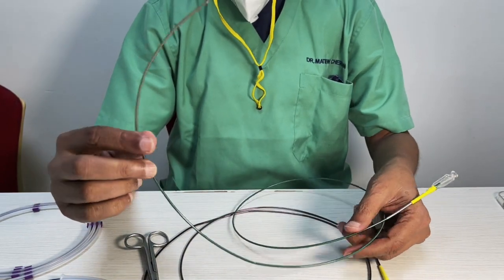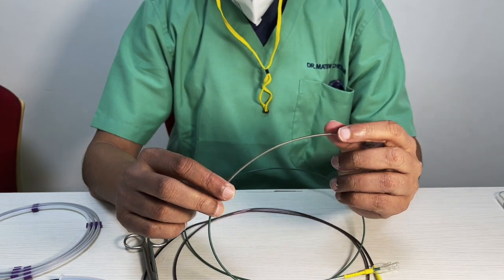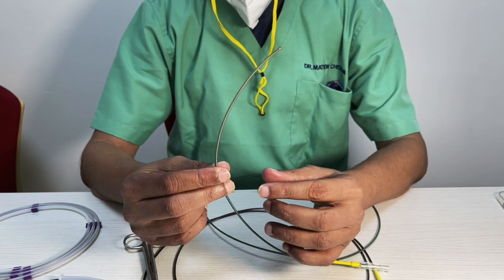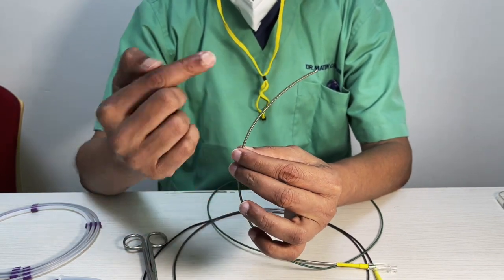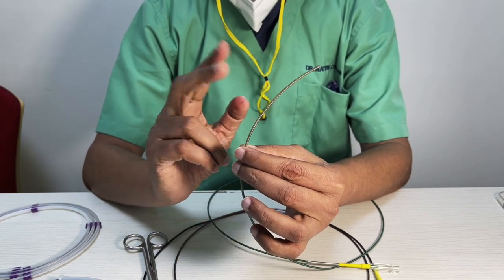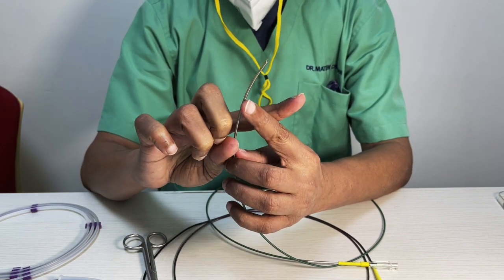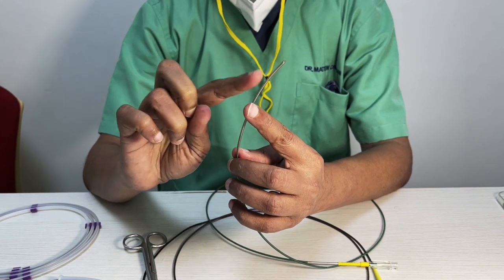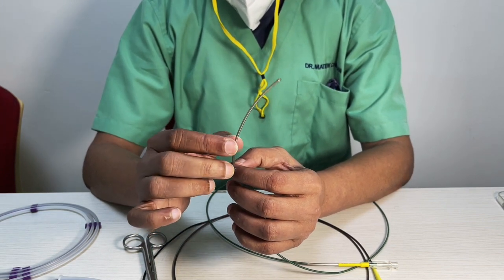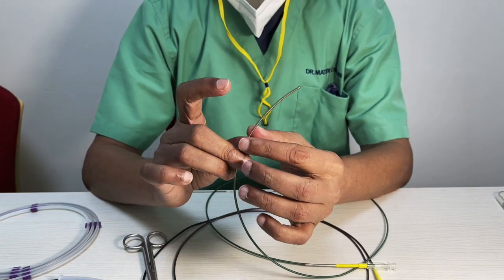So see, the difference between a Neuron and a guiding catheter is just the way it was constructed. The construction in a Neuron is based on the fact they got multiple zones. So they have got a first zone, which is made of transparent material. Inside this, they are running a spiral, not a weave. For the matter we saw in the guiding catheter, they were running 2 strands of steel as an X running all across. That gave tremendous pushability. Now, the problem is trackability is much better if you change this X and make it a spiral.